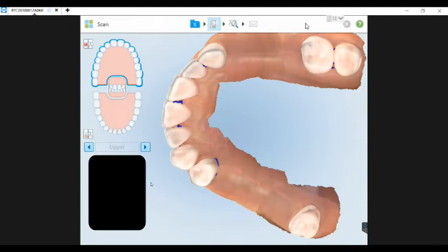The other tip I might have, and it's funny because I know the people from iTero say it doesn't have anything to do with the use of this next item, but it slows my mind down enough to follow a path. That's something called a Dr. Thompson stick. It looks like a little toothpick with indelible ink at one end. When you moisten the end, you can use that tip to draw on the patient's palate. I like to make X's and follow the X's, or perhaps almost like a Christmas tree mode from the postpalatine line, and zigzag on the palate left to right, ending behind the centrals at the rugae.